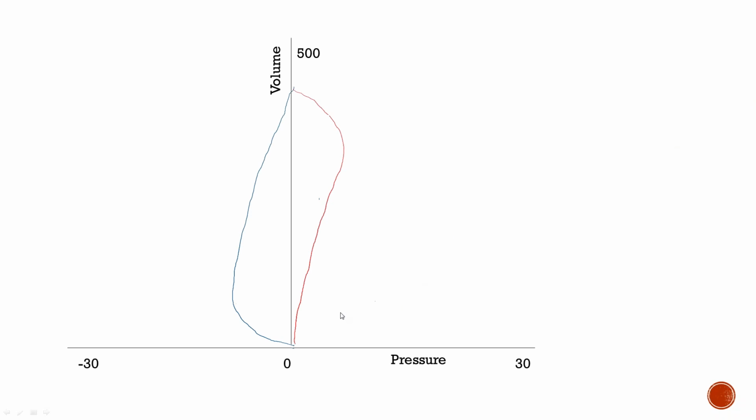All right, so everyone has their picture in their mind. Is this what you imagined? Yeah, so the spontaneous breath is completely different than a ventilator breath on a pressure volume loop. So which side of these is the inspiratory side, left or right? Left, yeah, so you can see as my awesome arrows show, the blue is the inspiratory side, and the red is the expiratory side. I'm bad with colors. Those are the colors that I think they are.